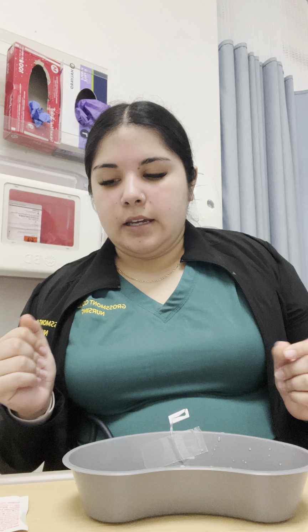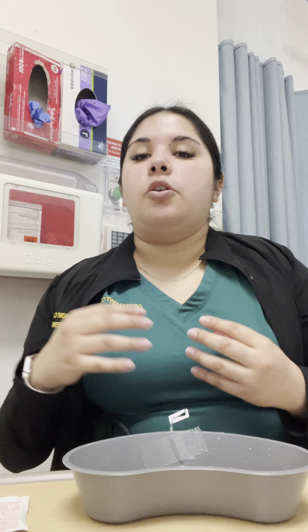So I will be administering an IV push medication. The medication I will be administering today will be metoprolol, which is a beta blocker. Along with this, I would explain to the patient that it is a beta blocker, which will lower blood pressure and or heart rate.